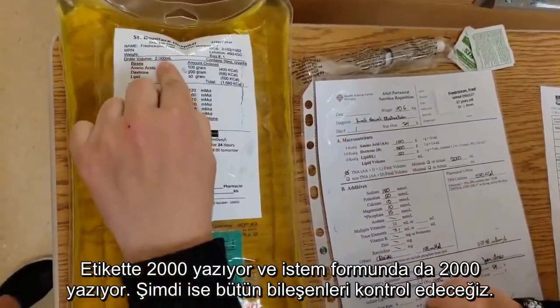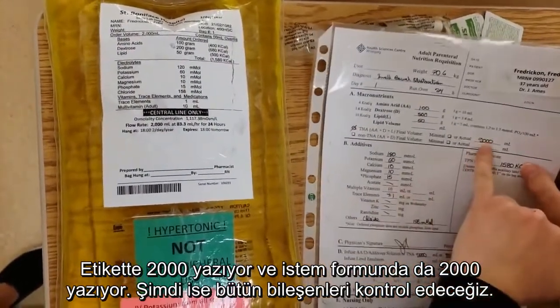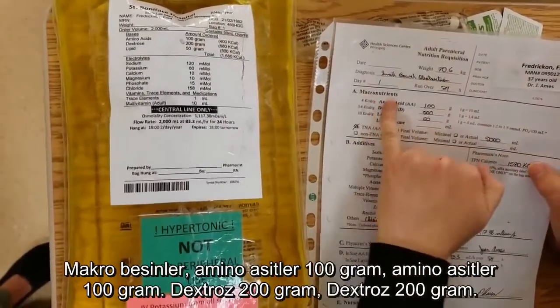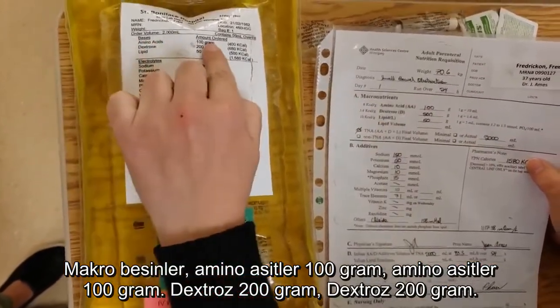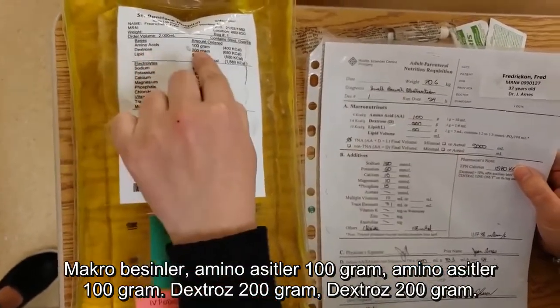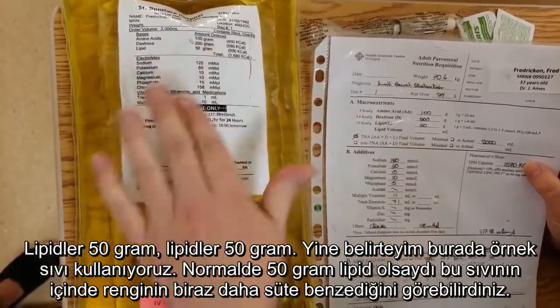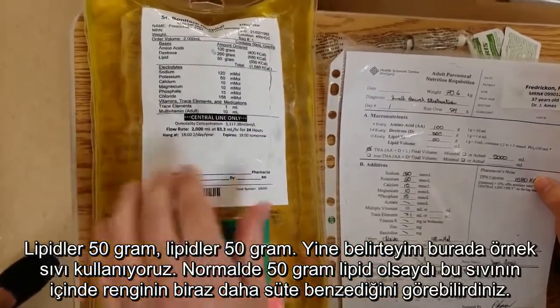The order volume is 2000, and we have on here the order for 2000. Now we're going to go through all of the components. Starting with our macronutrients: amino acids 100 grams — amino acids 100 grams. Dextrose 200 grams — dextrose 200 grams. Lipids 50 grams — lipids 50 grams. Again, if the 50 grams of lipids were in this, you may see that the color is slightly more milky.